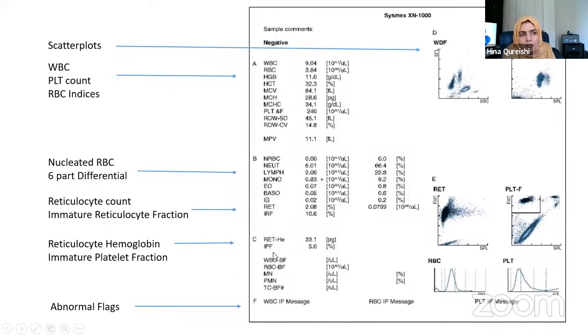And in the instruments, you have the capability of running different types of samples. So if it's run on blood, usually we just see the counts for the peripheral blood. But if it's run on, let's say, CSF or a pleural fluid, then we change the setting on the instrument to evaluate the fluid chamber, and then we get the body fluid counts like here.